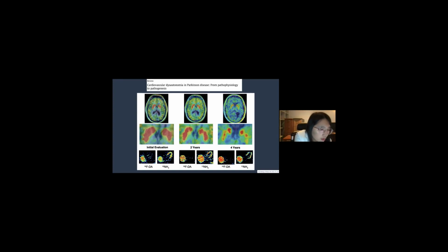These cases illustrate that cardiac sympathetic noradrenergic denervation happens several years before development of Parkinsonism or neuroimaging evidence of striatal dopaminergic lesions. The heart-to-mediastinal ratio and regional uptake pattern of cardiac MIBG scan is a more sensitive tool than standard autonomic testing or clinical symptoms for detecting cardiac sympathetic denervation in PD.